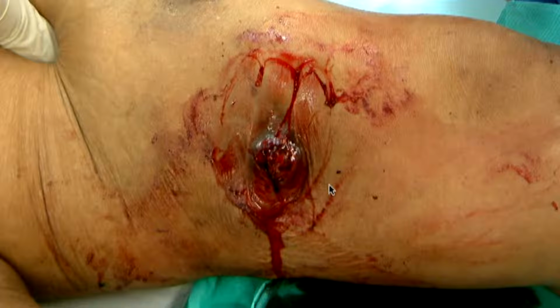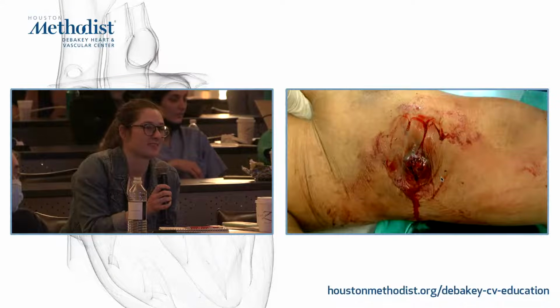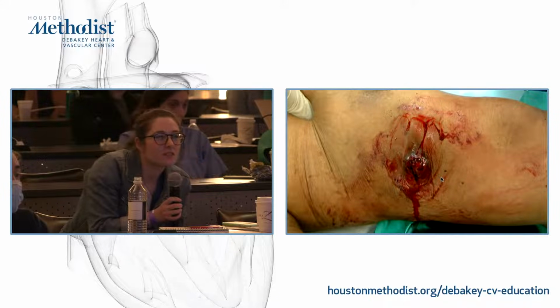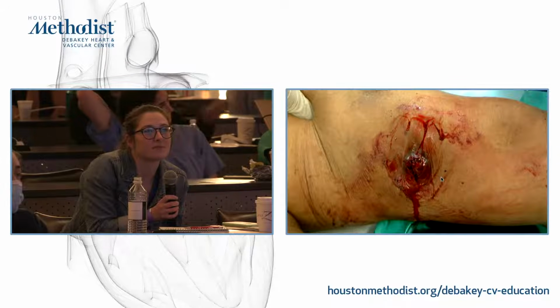What are they doing? Is that person just torturing the patient a little bit more, or what are they actually trying to do here? They're trying to hold pressure. Well, they're holding some kind of pressure. They're actually trying to thrombose, to occlude the graft. So they're trying to feel where the graft is, and that's not that easy to do, to be completely honest with you. They're trying to control any bleeding that's coming out of that by pinching the graft.